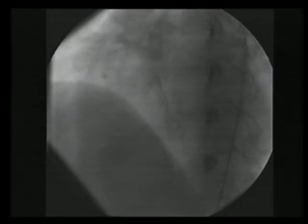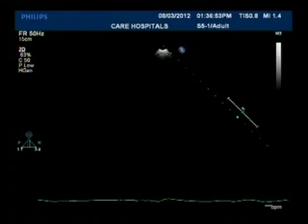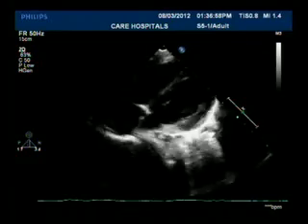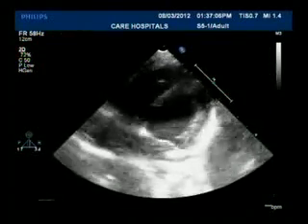What we do is we'll do an echocardiogram here to make sure that you are above the moderator band. These are end hole catheters, so you have to ensure that it is a free flow. So show the echo picture. Some of us would use a so-called buddy wire through this in order that it doesn't get kinked. Because being a tortuous course, there is a tendency for this catheter to get kinked as it enters the RV. Particularly this Cook sheath is quite sturdy, right? Yeah, Cook's sheath.